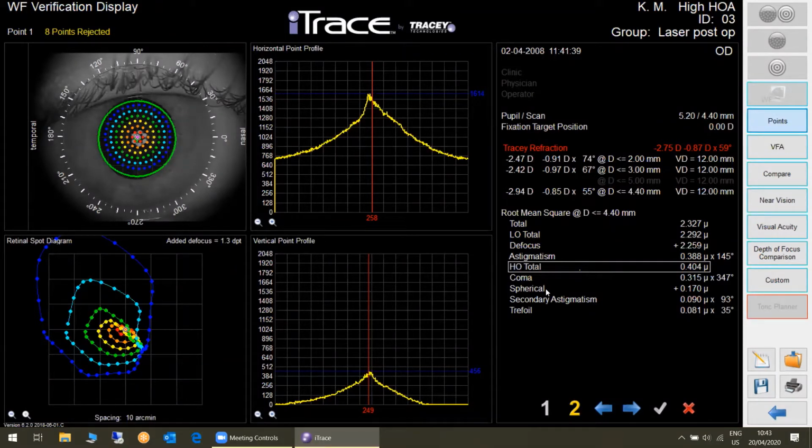If you look at the sphere, at the football, then you know it's round. But if you look at only a small part, then it's flat. So that's why if people talk about spherical aberration inside of 2.5 or 3 millimeter, that's impossible.